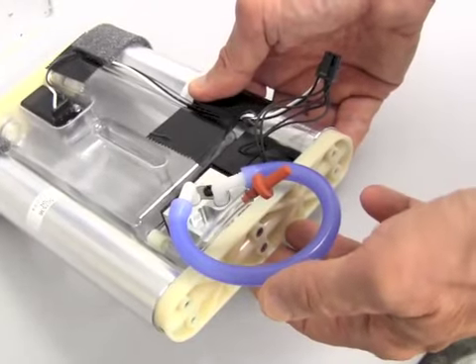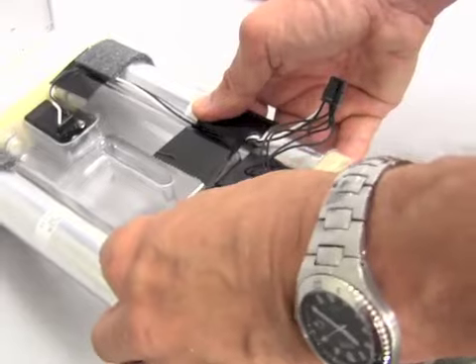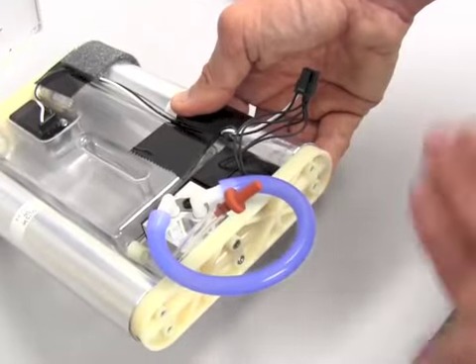Okay, the next step is to reinstall the sieve bed assembly, and the first thing you have to do is remove the Tygon tubing and the plug that you put in place to keep the sieves from getting wet.